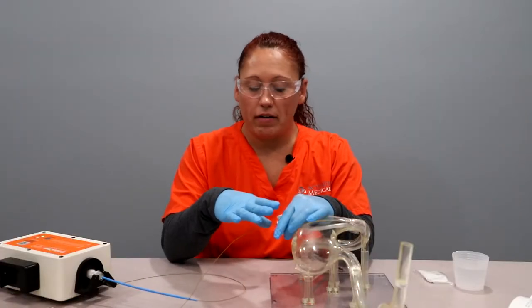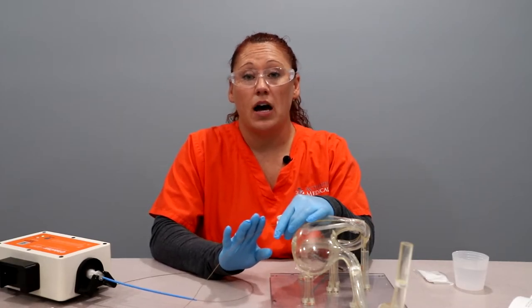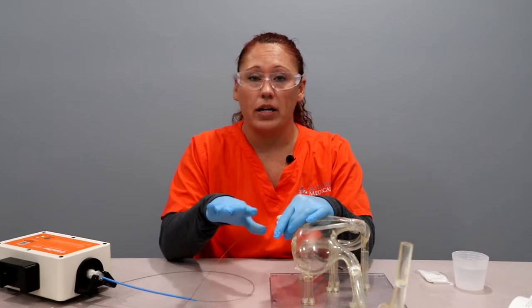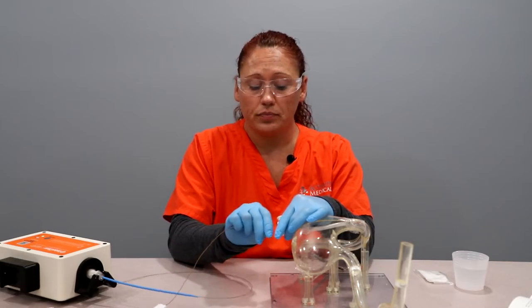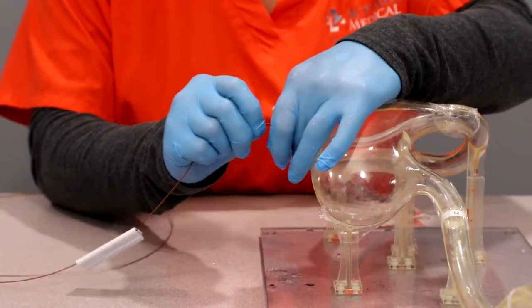These tubes have a very complex geometry and the GI system is very curvy, so this can take some time. It could take up to an hour. Don't get frustrated, take breaks as often as you need. We will work on this until our depth limiter reaches our port.